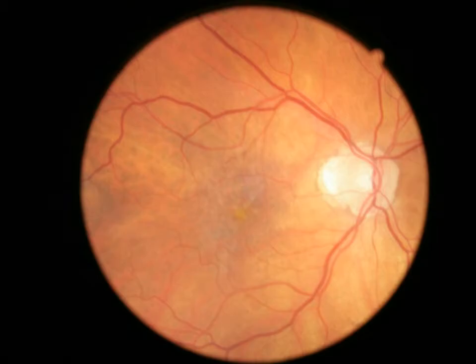Well, one of the ones that I thought I was going to be using the instrument for the least amount, which has actually occupied about 50% of the posterior segments, is for those individuals with macular degeneration. Why are we scanning individuals who have macular degeneration with an OCT? Well, this patient right here, this is a picture of their right eye. They have 20/60 best corrected vision in the right eye, which is this eye, and 20/40 in their left eye.